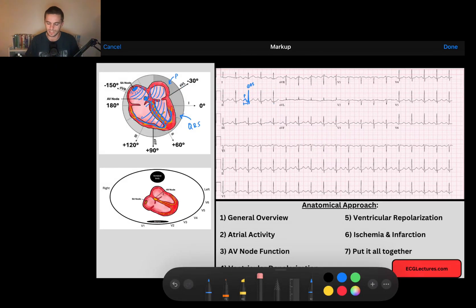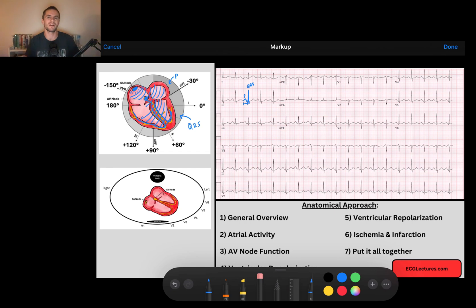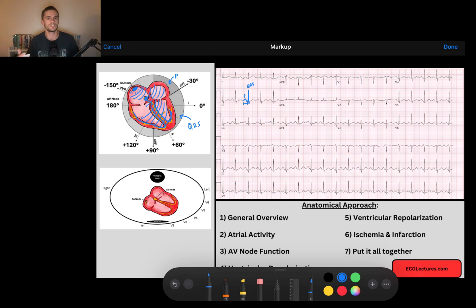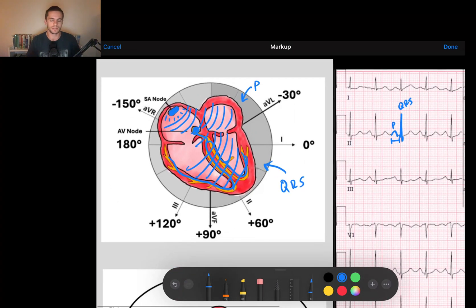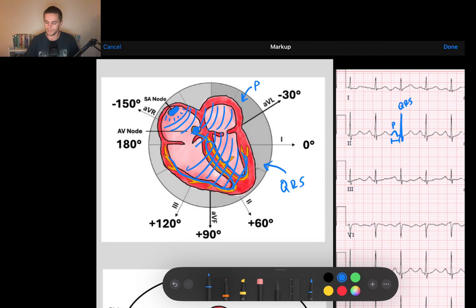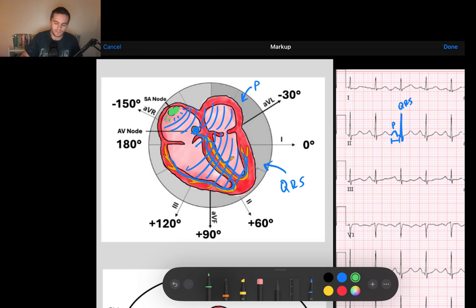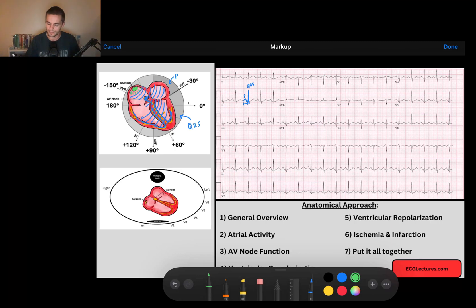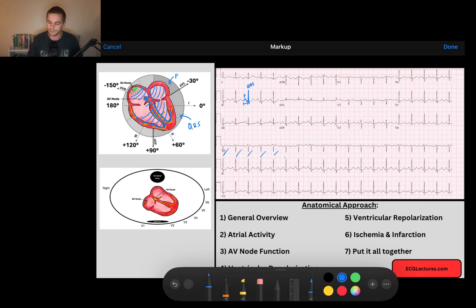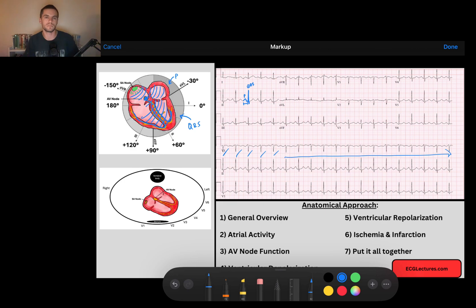And what are some details that might allow for us to feel more confident that we can diagnose a sinus rhythm on an EKG? Well, the first thing is that we know that the sinus node behaves in a predictable pattern. We know that its job is to pace the heart regularly. So we know that these impulses that are originating from the sinus node, they should be firing off in some type of regular fashion. It's not going to be always exactly perfect, but if you look at here, this rhythm, you can see we have nice regularly occurring QRS complexes that are nice and steady throughout with little variation.